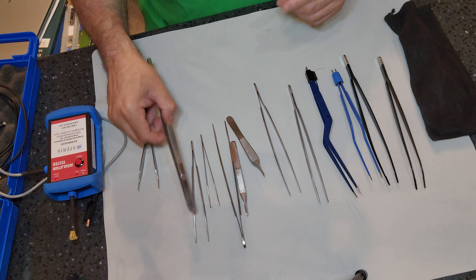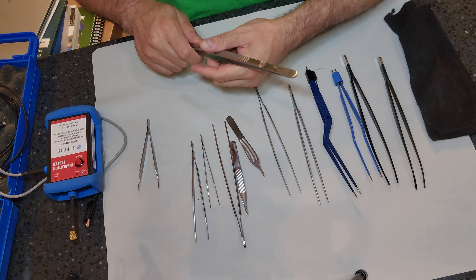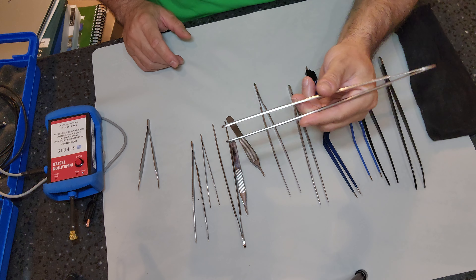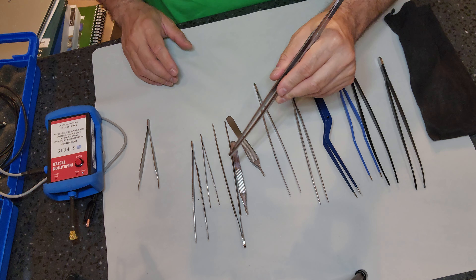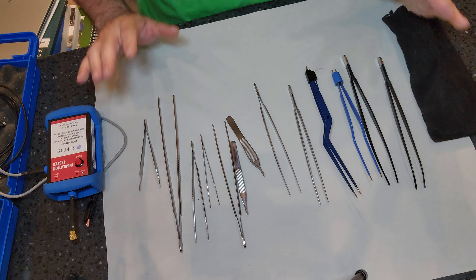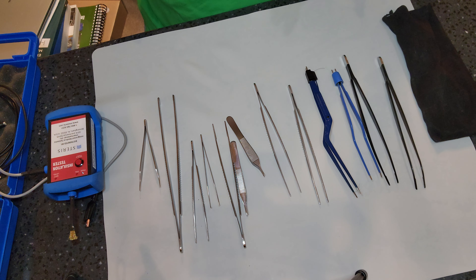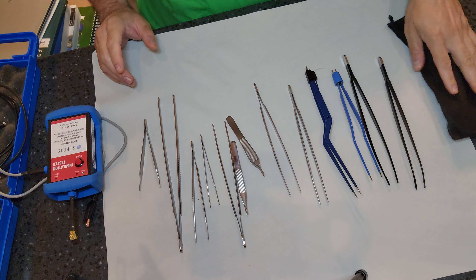It's called a thumb forcep because it's operated with the thumb — even though you use your index finger too. It's almost like chopsticks in a way. Forceps come in every variety, style, size, and color you can think of. There are forceps out there.